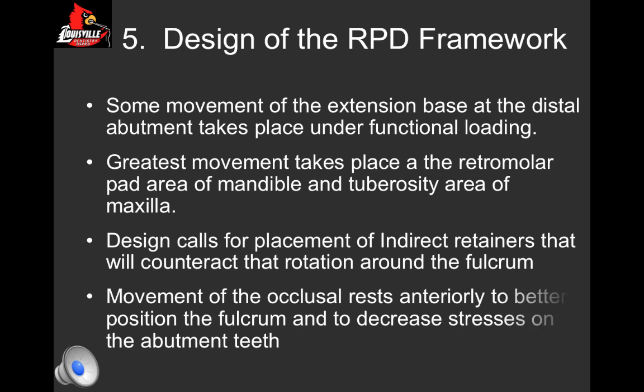Movement of the occlusal rest anteriorly to better position the fulcrum and decrease the stresses on the abutment teeth is also called for. An example of this is the use of our I-bar direct retainers.